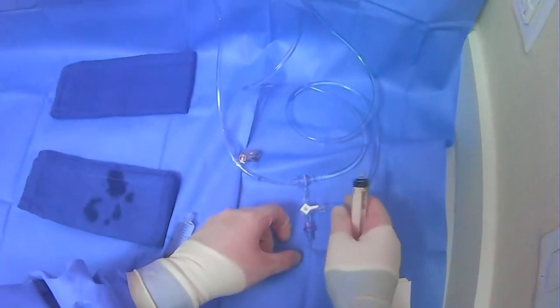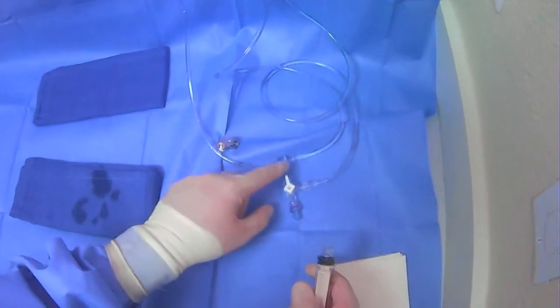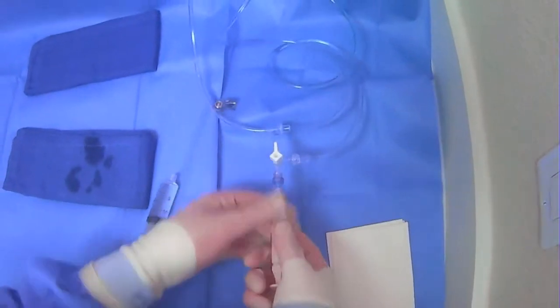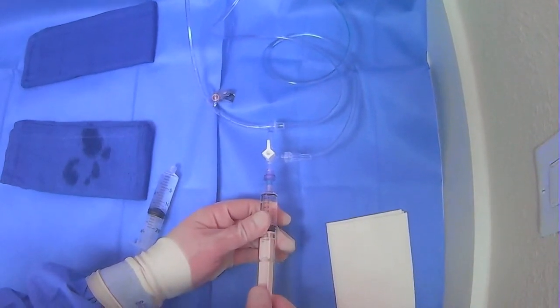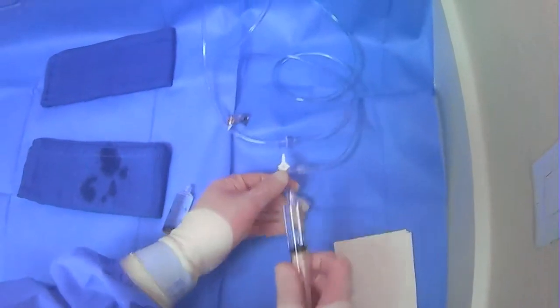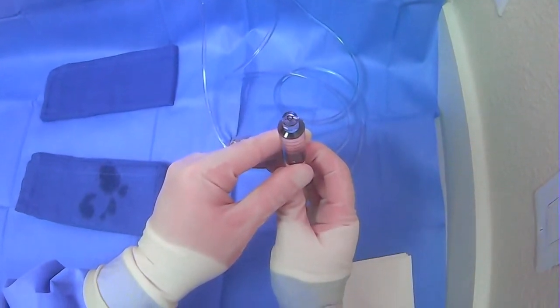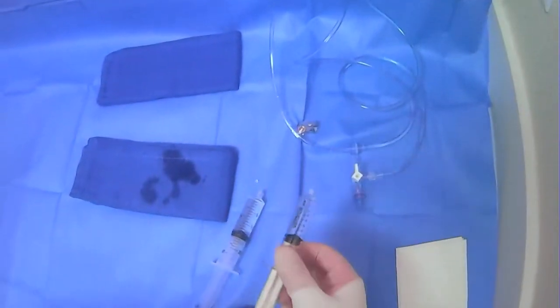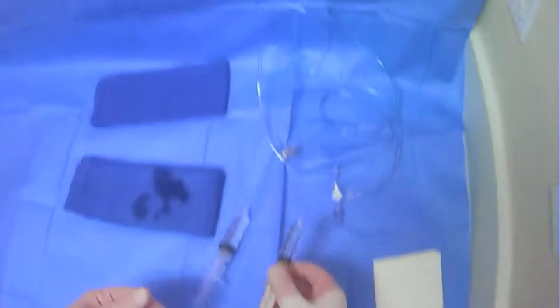To draw contrast, move the stopcock orientation to block off the saline line and draw contrast from the contrast port. Then do the same thing — push out all the air onto the towel. Usually we fill these halfway or a little bit more than halfway so we can aspirate.